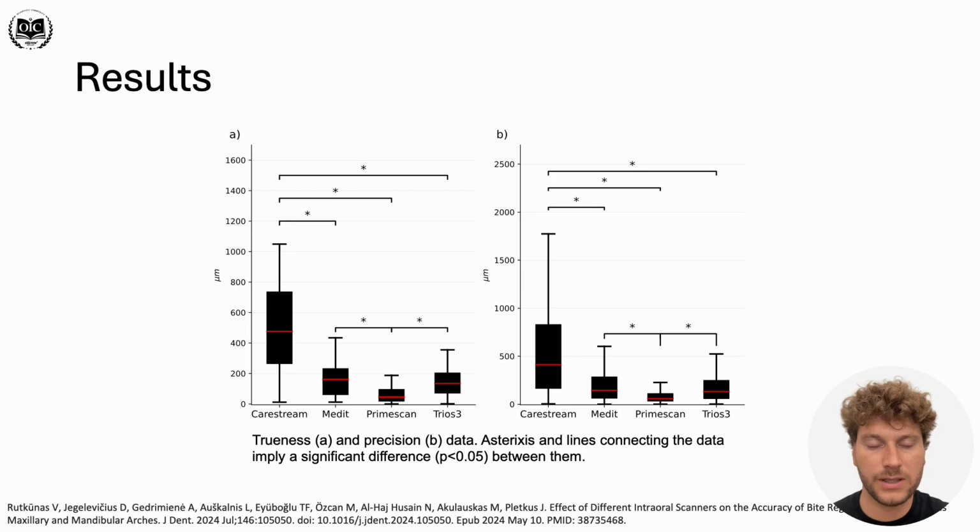Our results show that scanners performed quite similarly, and according to trueness, the deviations were somewhere in the realm of 100 to 200 microns, and precision was about 200 to 300 microns.